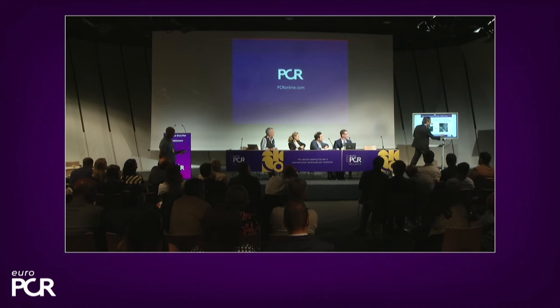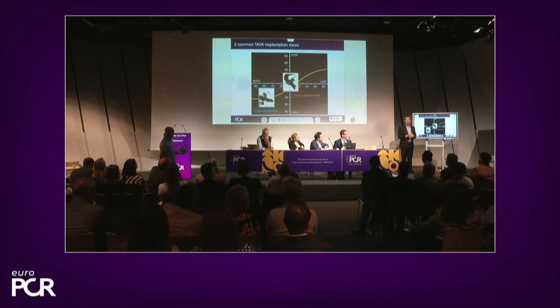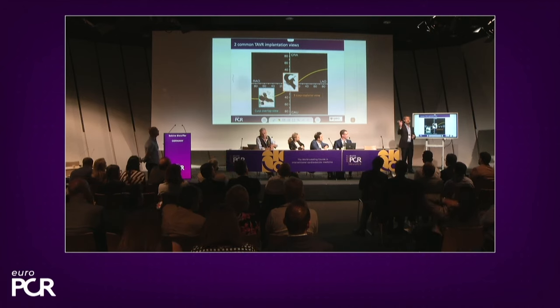And so what we ended up doing was we got the aortic annulus S-curve that you see there in yellow, and then we developed the S-curve of the delivery catheter. We're not going to go into details on how you do that, but you just need two orthogonal views about 30 degrees apart. You take those two views of the delivery catheter in plane, put into a mathematical equation, you'll get the S-curve of the delivery catheter, and it does something like this.